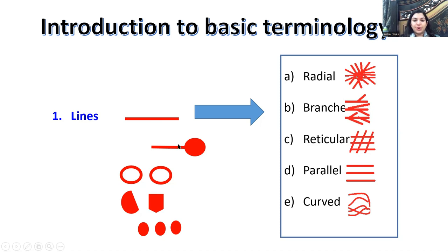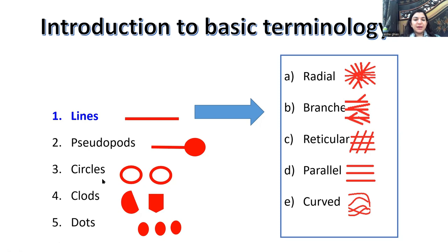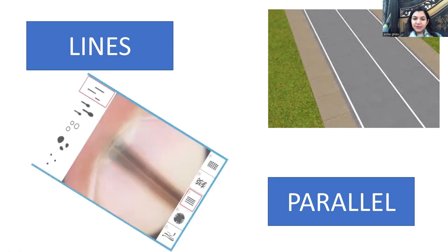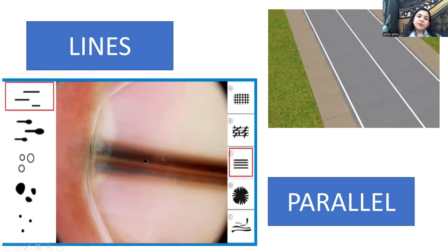Parallel lines in dermoscopy are visible in nail dermoscopy — on onychoscopy. You can see shades of brown — no gray, no blue — only brown, and these lines run parallel to each other. The band widths are almost the same, though color varies. This is a subungual nevus — an example of parallel lines.